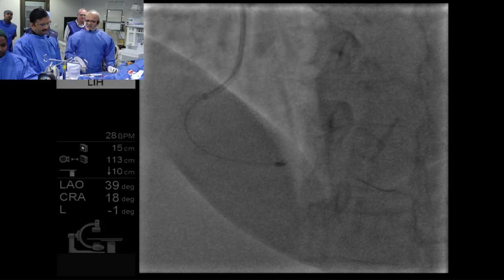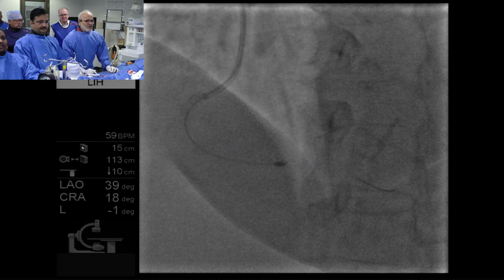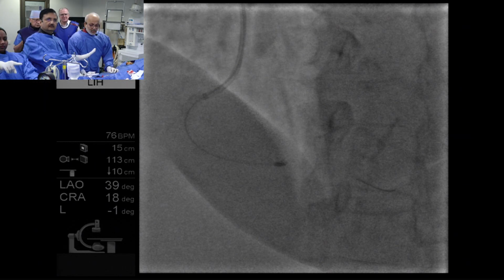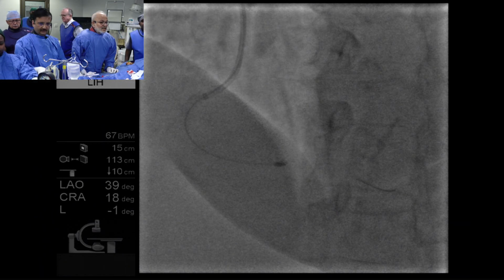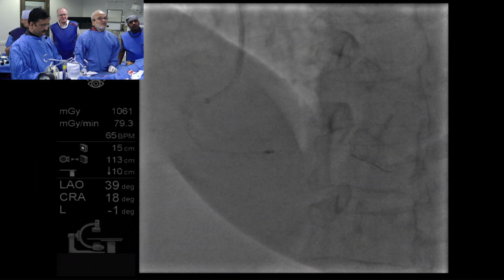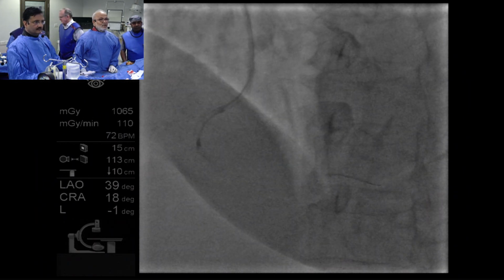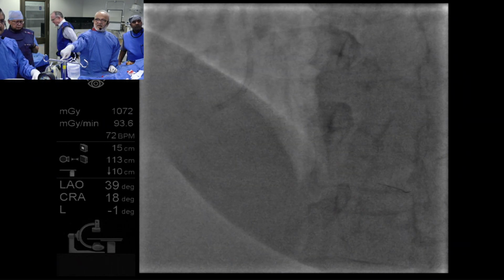Okay, I think this is enough. Now, the important thing is just see the coordination, how we come out. Dyna off. Wait. That is Brady. We are fine. Okay. Dyna on. Okay. And now Sanjay will remove it. I will simply keep this in hand. Just camera here.